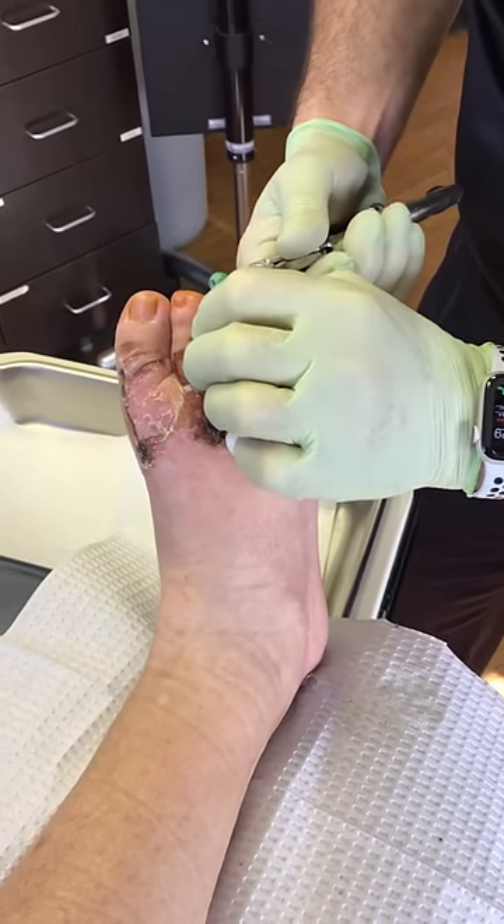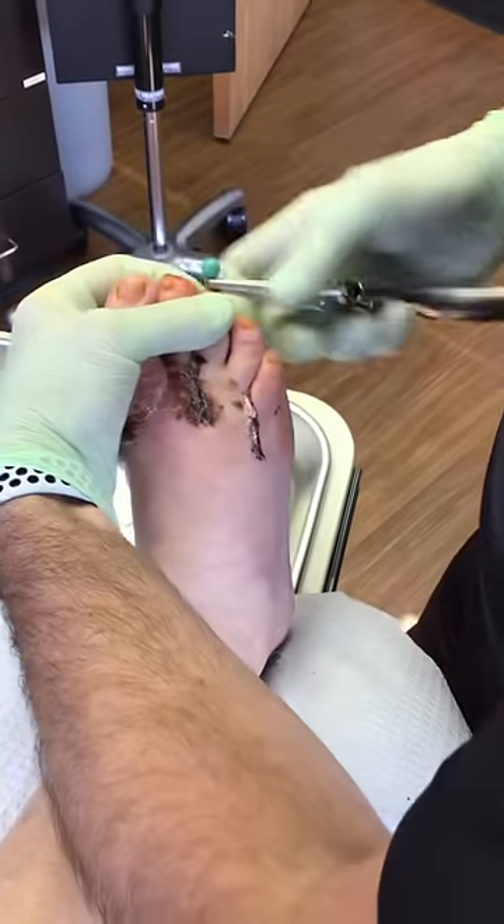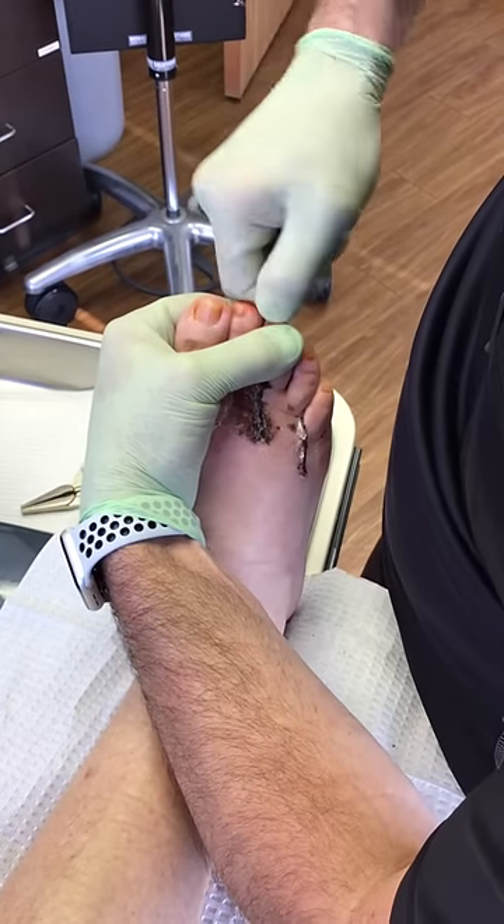Just try to relax as best as possible. I know, I know. This isn't fun. Take that off.